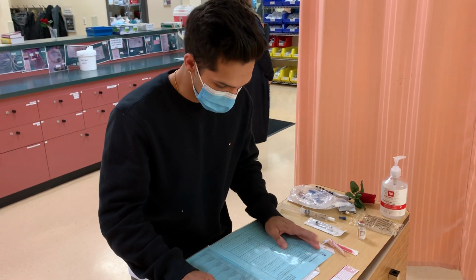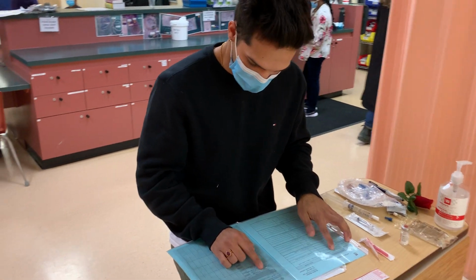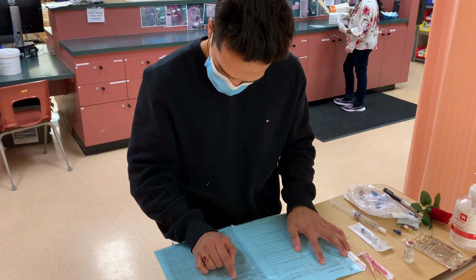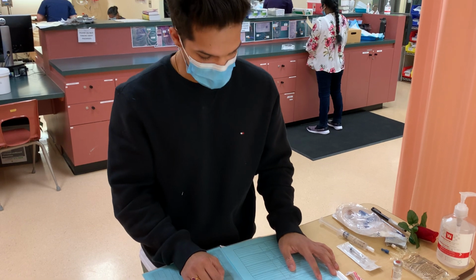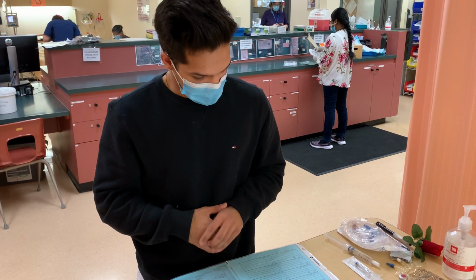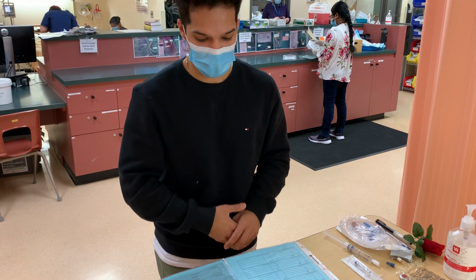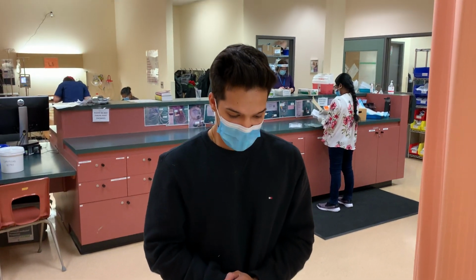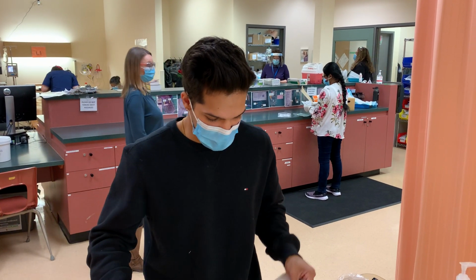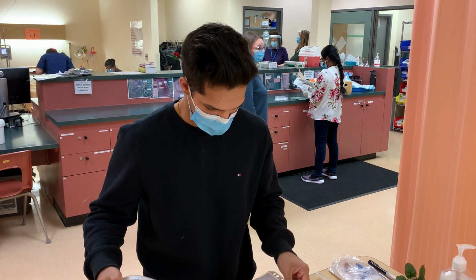And as you can see, we have orders for insulin Humulin R, continuous IV infusion at 2 units per hour, and normal saline at TKVO. So that's good to know. And as I can see, both of these are signed by transcriber and reviewer, so I'm good to carry out these orders. So the first thing I'll be doing is putting those away, and then I'll be taking out my PDM for my insulin.